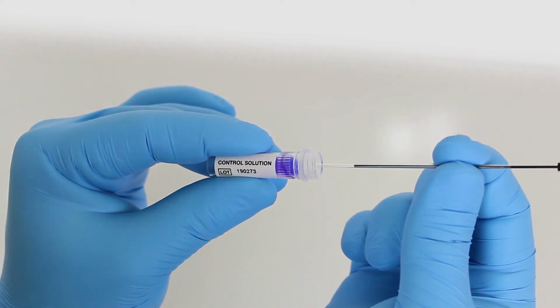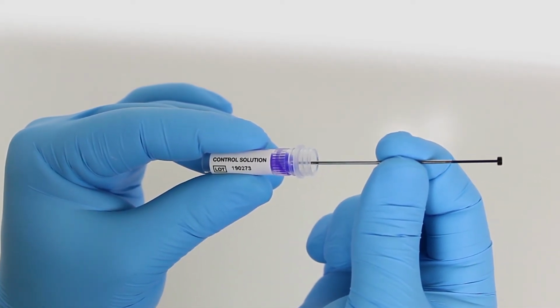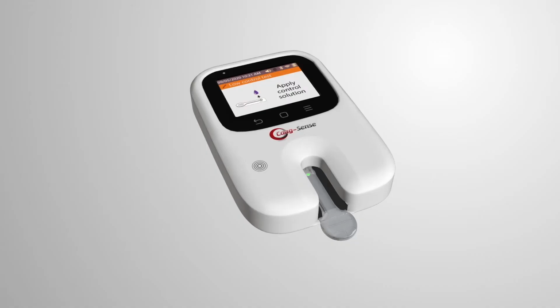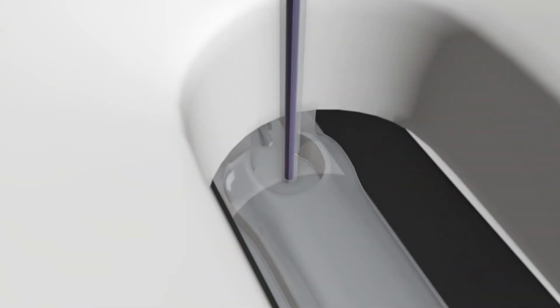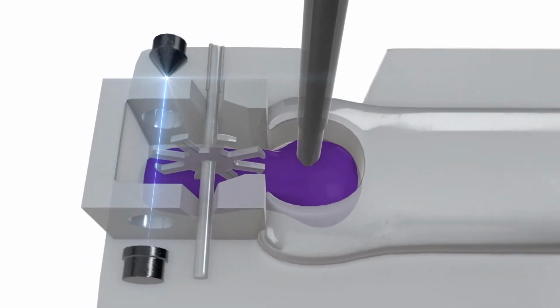Insert transfer tube into control activation solution. Let capillary action fill until solution flow stops at the white plug. Insert transfer tube tip into the sample application well of the test strip, touching the tip down at the flashing green light in front of the wheel. Depress black plunger completely to dispense the activation solution.